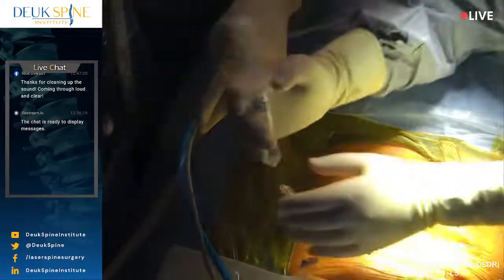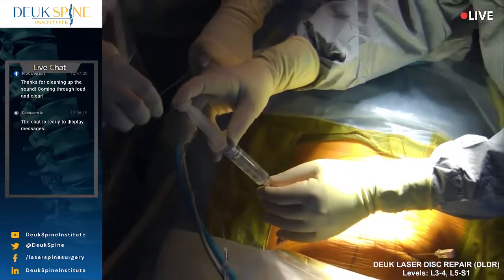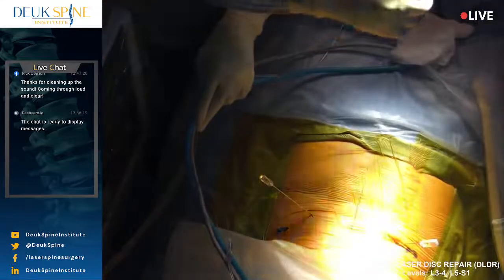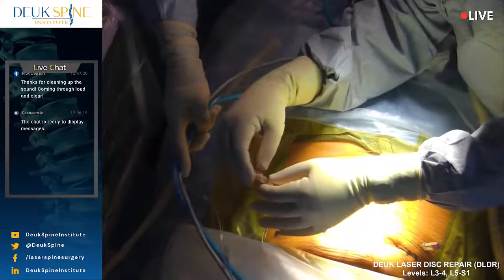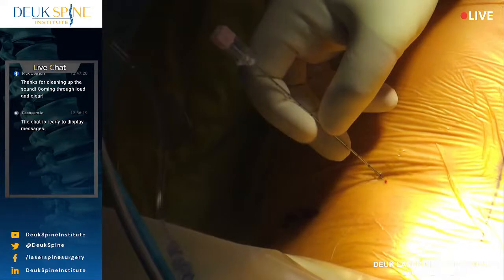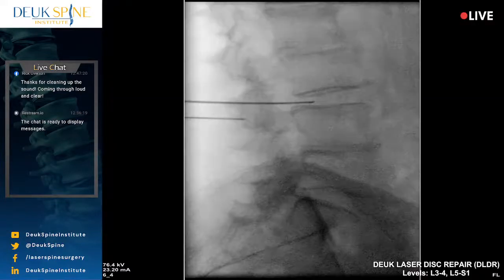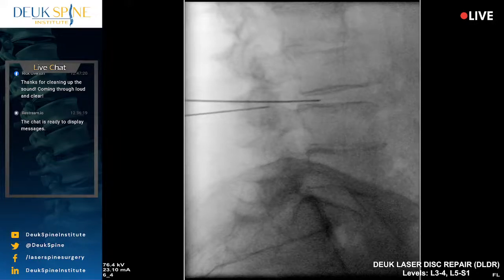So our patient needs to be awake so that they can help me navigate to where I need to go in the spine. I apologize. That was just some numbing medicine going in. I know it's uncomfortable. You're doing really good. And patients don't know what's going on really during the surgery unless they've watched quite a few of these. But I like to give them some encouragement if things are going well, just to make sure they know everything's okay. Because what they may be feeling and what they may be hearing are two different things. They may think, oh, there's a problem, but there's not a problem. Everything's okay.